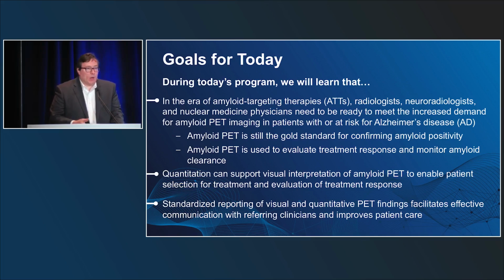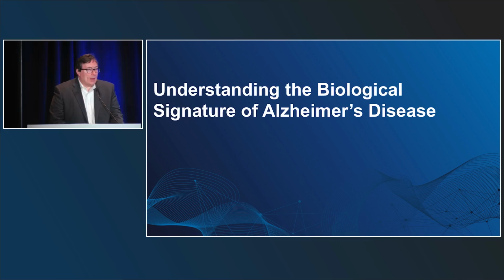And as we talk about standardizing both the visual and the quantitative PET findings, it'll allow you to more effectively communicate with referring physicians and improve patient care through the most accurate assessment possible. So with that, I'm going to turn this over to Phil, and we'll get started.